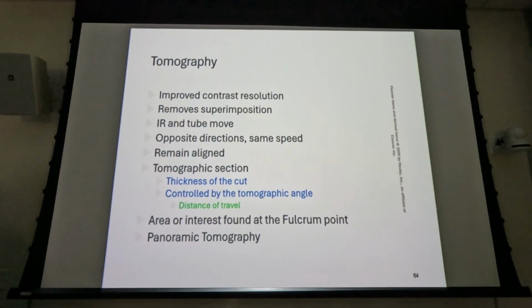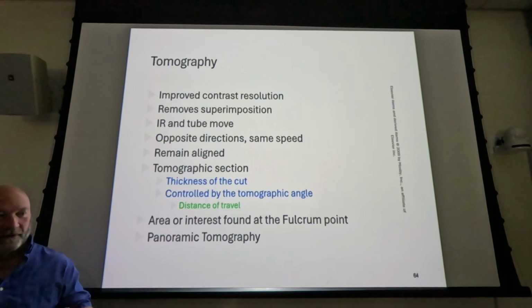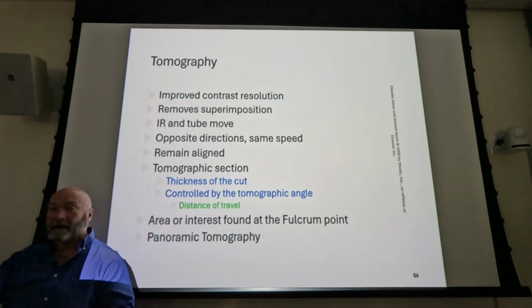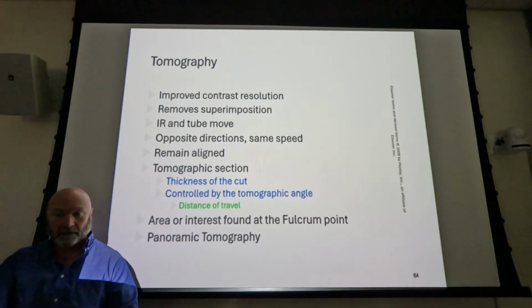Anybody have, I just lost the name of it. The thing that goes around your head you get in the dentist's office that gives you an image of the jaw and your teeth. Panorex. No? Nobody has that in the ER anymore? Okay. Oh, no, not in the ER.